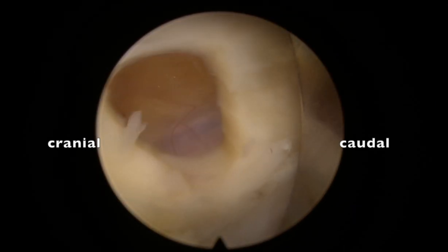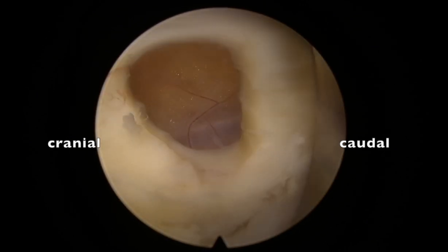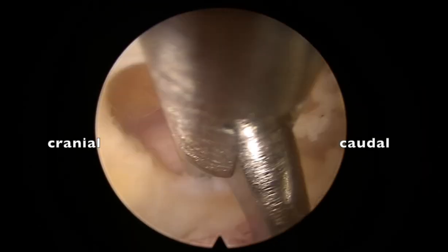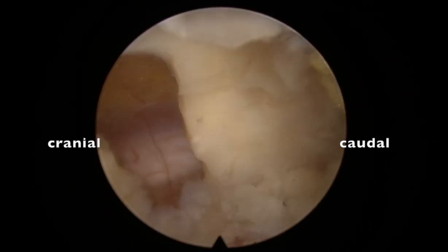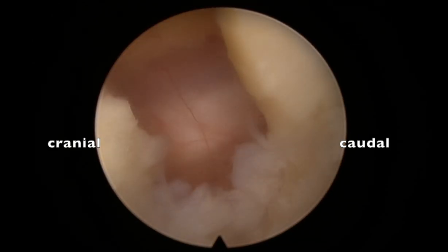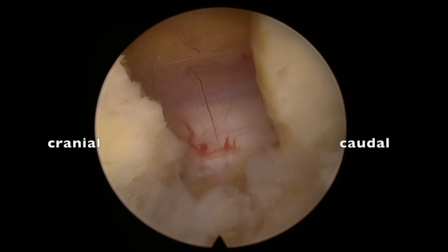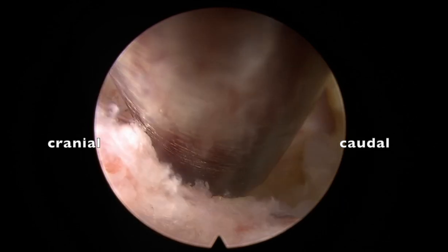Cut from medial to lateral — medial to lateral is always ideal because medially you have an epidural cushion. I'm cutting from medial to lateral towards the facet area. Once this is done, you can see the recess we have drilled nicely. Removing this ligament — once this epidural space is exposed, drilling might be risky.